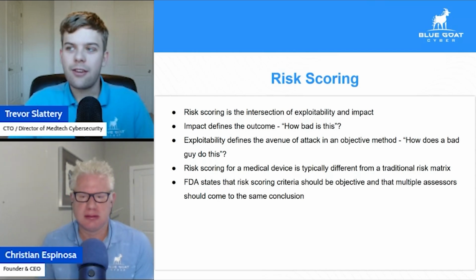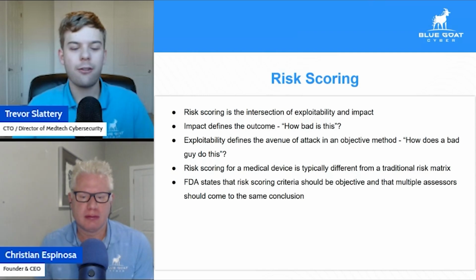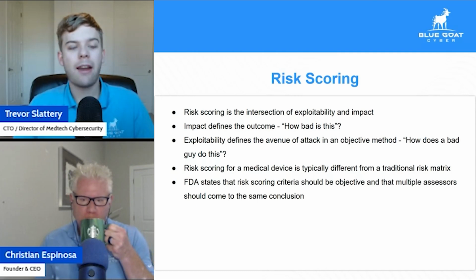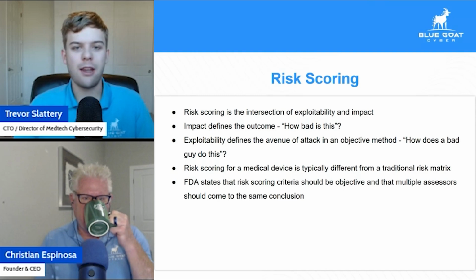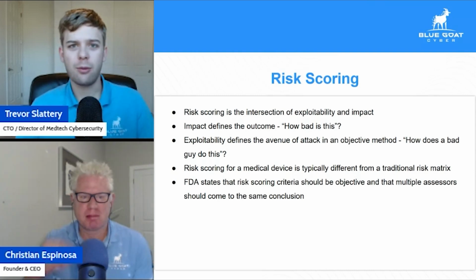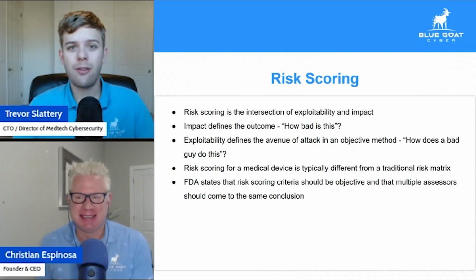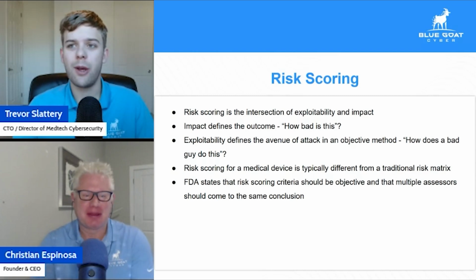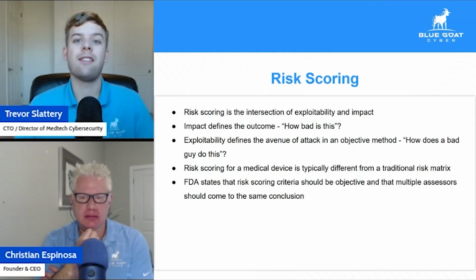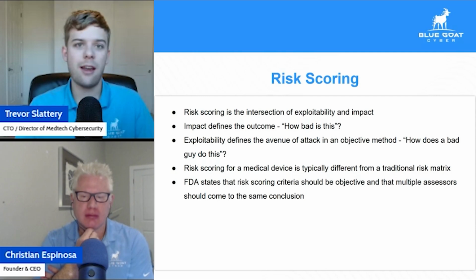Well, it can depend. In general, patient safety, of course, has to be the top concern. If someone can get hurt because of a vulnerability, that's a massive problem. Having said that, let's say the patient safety impact would be like a paper cut. I don't know how a medical device would give you a paper cut from a cybersecurity vulnerability, but just for the hypothetical, compared to hundreds of thousands of medical records getting disclosed, obviously the patient data in this situation is going to be the more severe example.